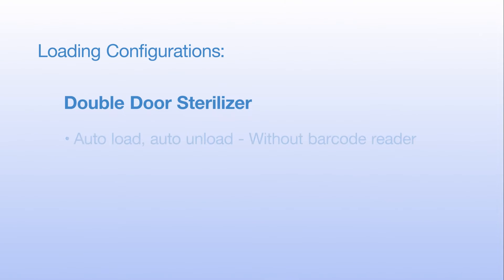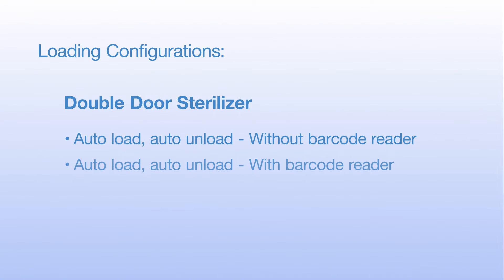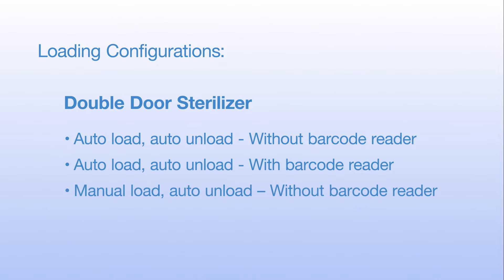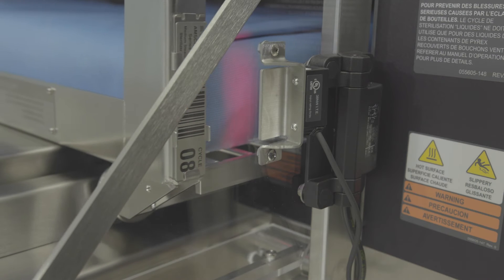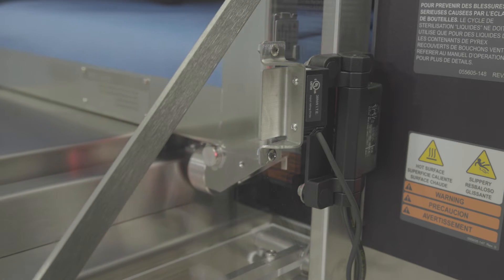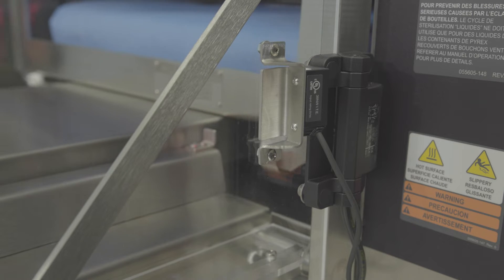Configuration options include: double door sterilizer with auto load and auto unload without a barcode reader; auto load and auto unload with a barcode reader; manual load and auto unload without a barcode reader; and single door sterilizer with auto load and auto unload without a barcode reader. To maximize efficiency, the optional barcode reader for automatic cycle selection is recommended.